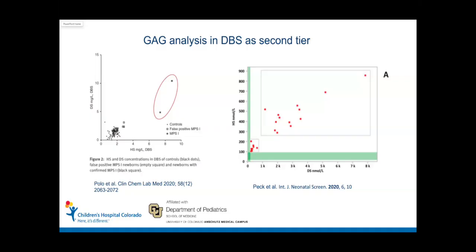And then some very bright people in several different labs, Dr. Tomatsu's lab, Mayo, a couple of other places, came up with this idea that we could actually measure the GAGs in dry blood spot, and we could do that from the dry blood spot that was used to do the initial newborn screen. And so these are some internal disaccharide measurements, and I know the one on the right came out of Mayo, showing that GAGs were elevated in dry blood spot samples from patients with MPS.